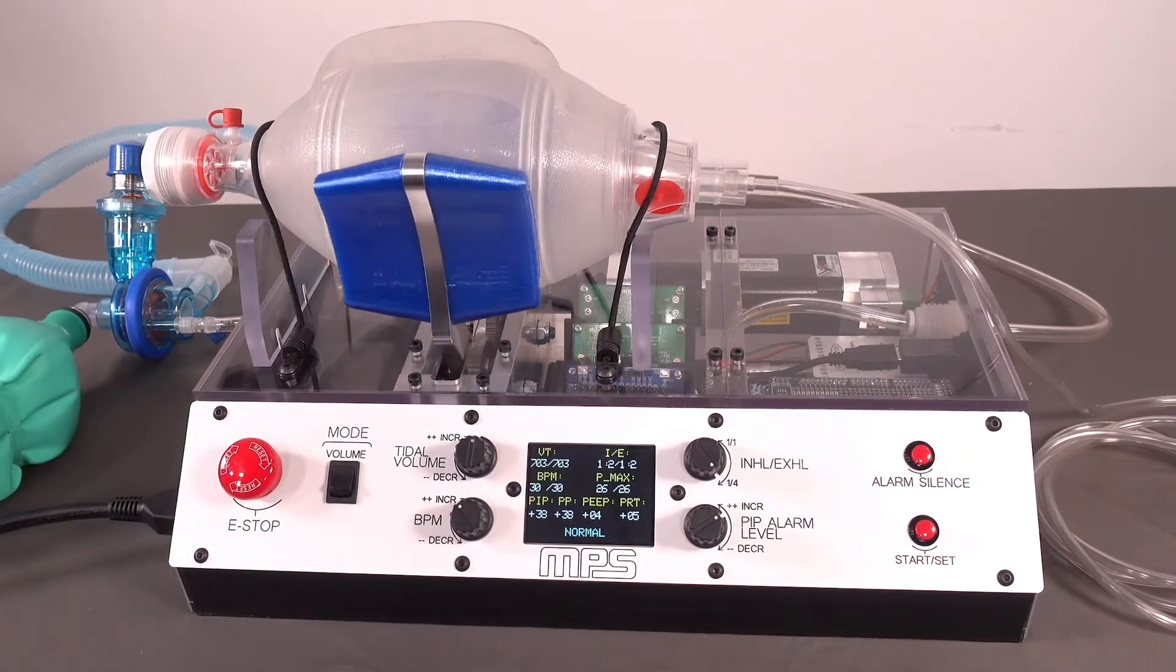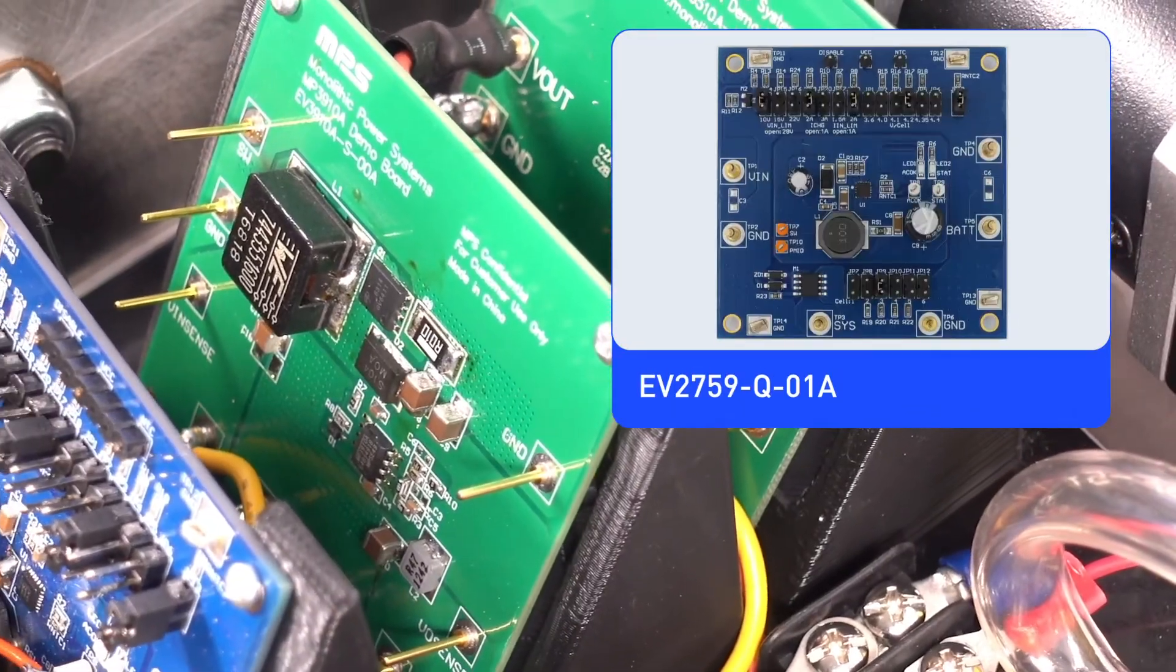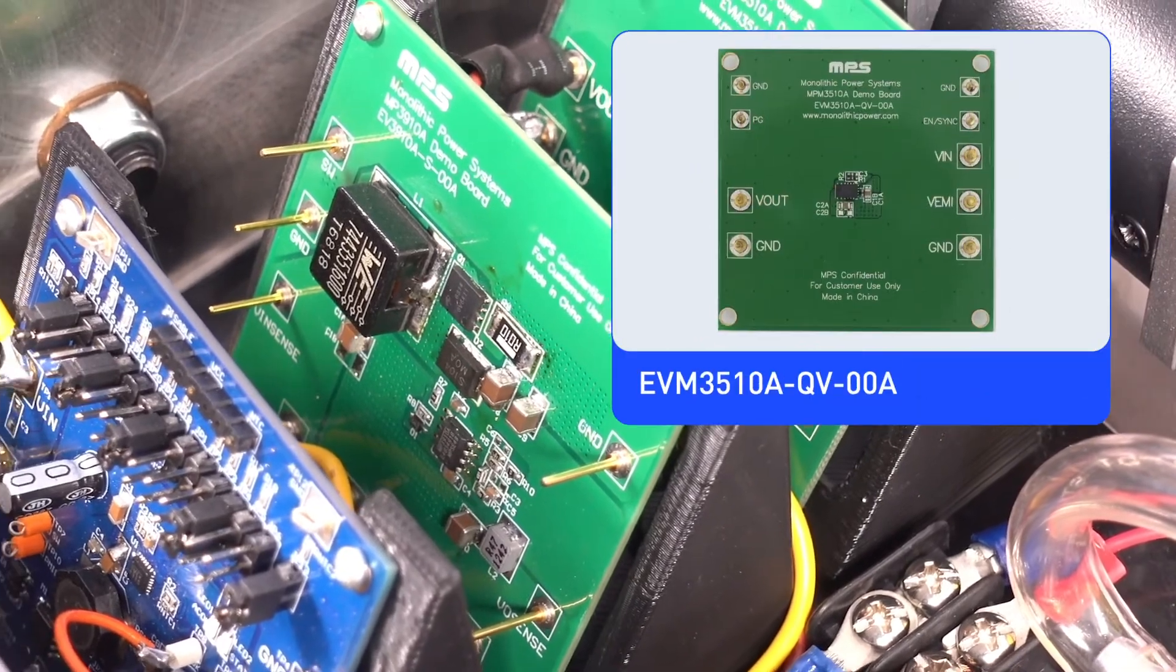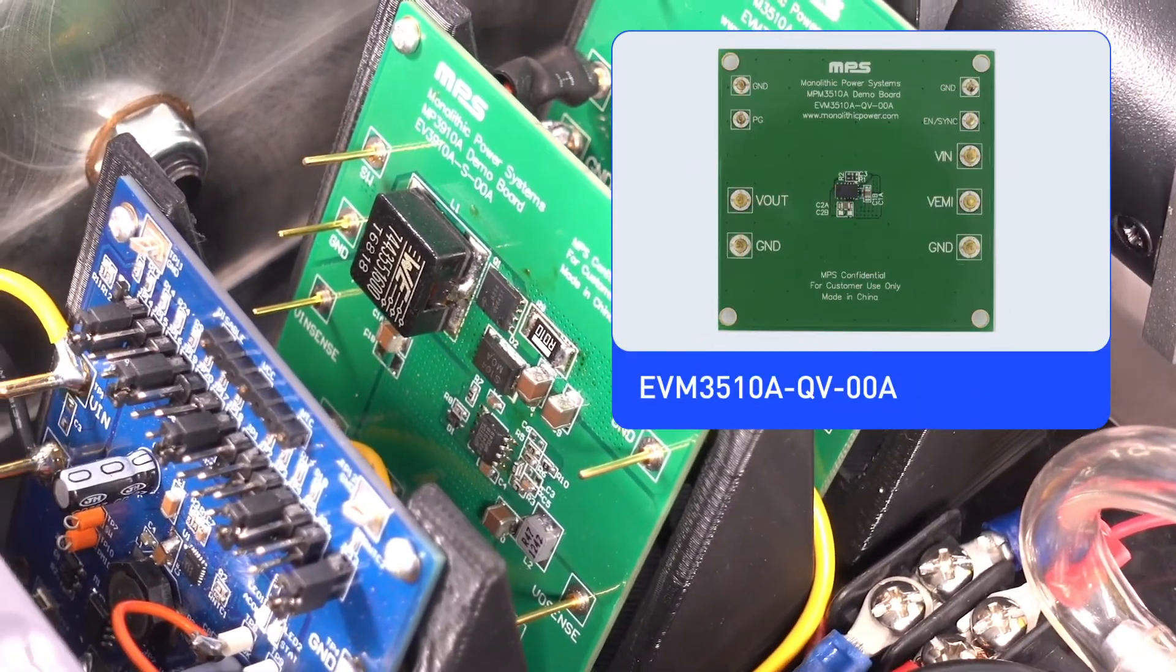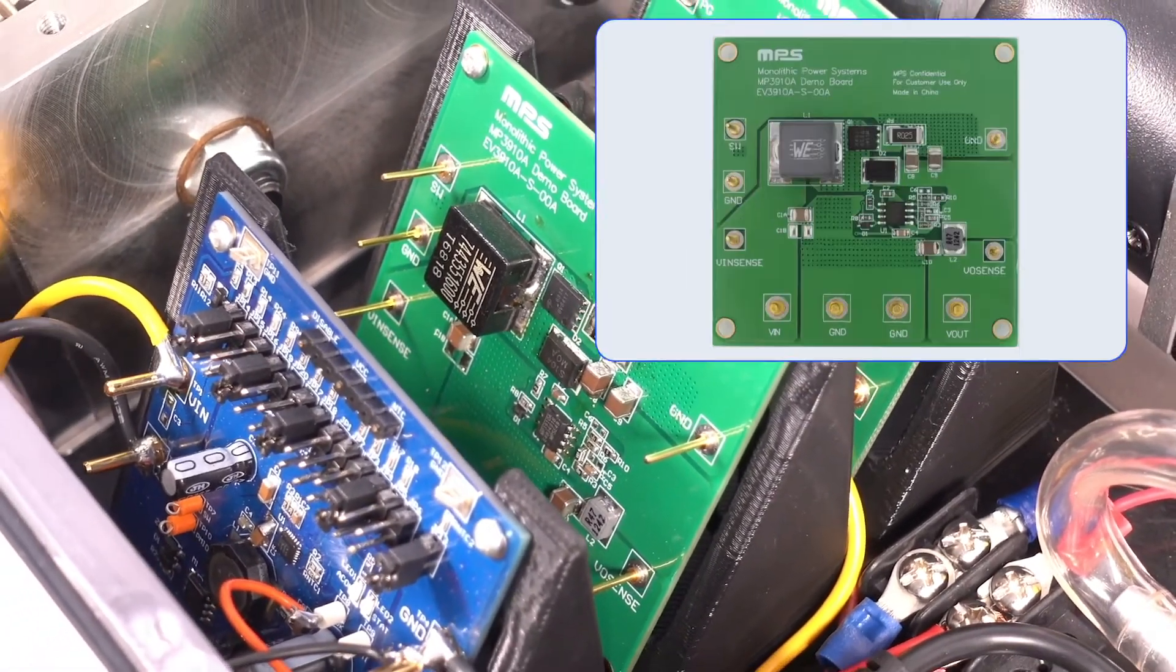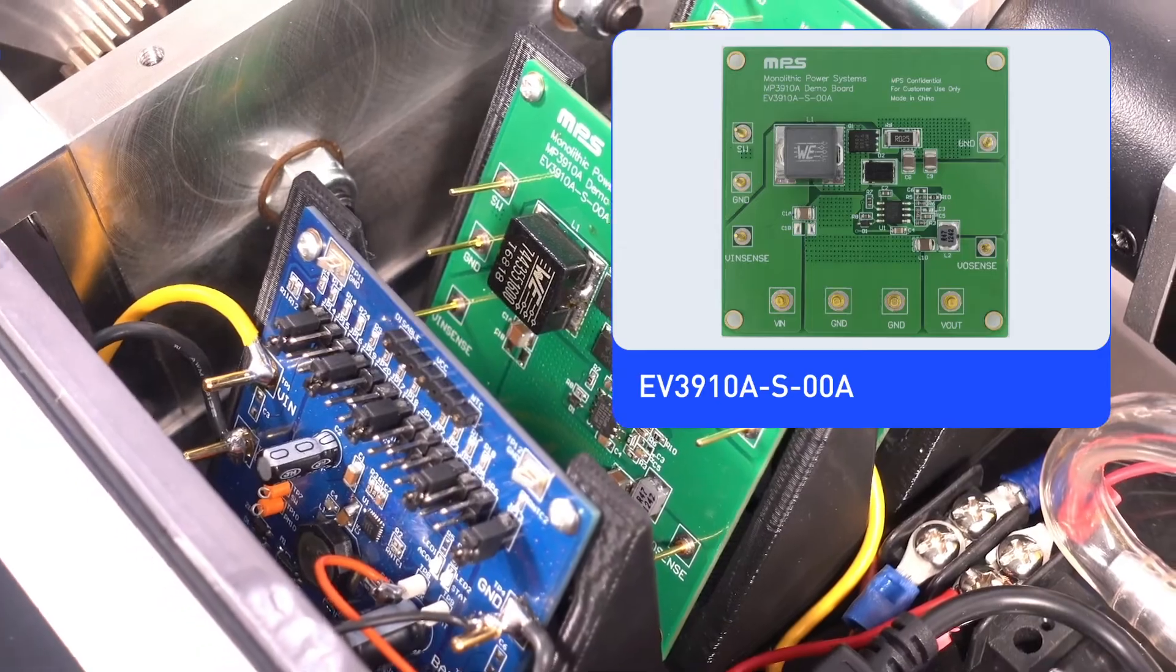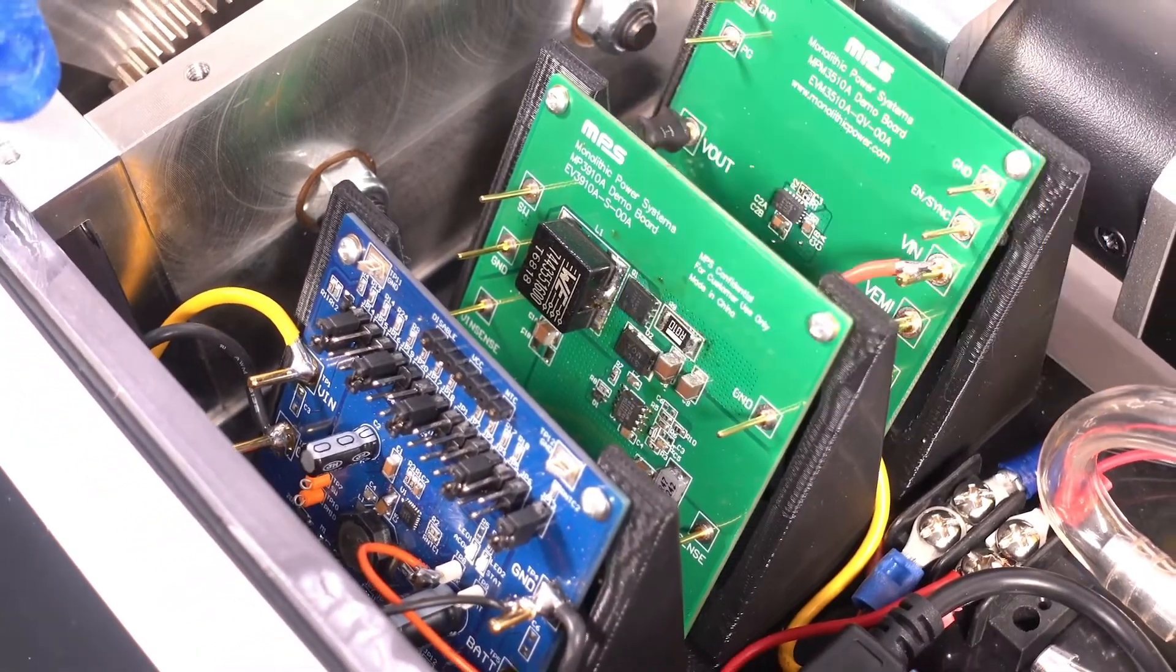SEPIC, MPS boost, and buck voltage controllers provide consistent, stable voltage to the smart motor and main control board, regardless of whether the power is being supplied by the AC adapter or the backup battery.